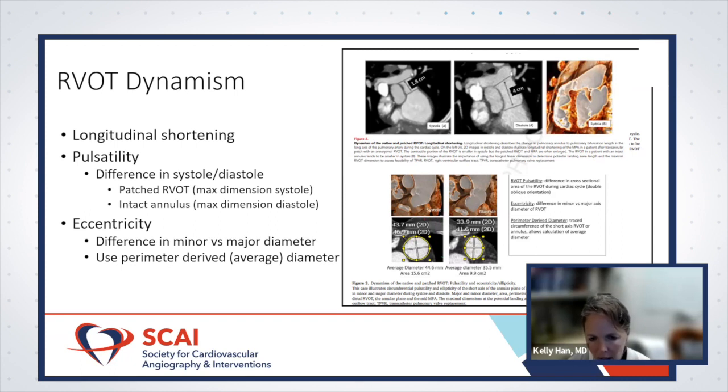In adults, you can do area as well, but that's more common in TAVR than in the congenital space. So I think it's important to get a functional scan, look at the maximal dimension for the linear dimension, and also look at the maximal dimension of the right ventricular outflow tract to see if that valve is going to sit nicely once you put it in there.